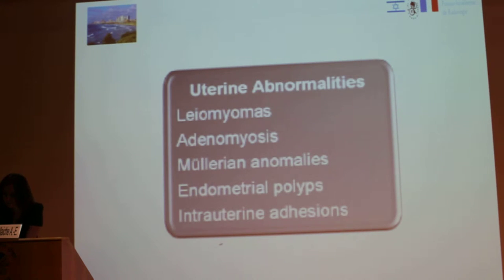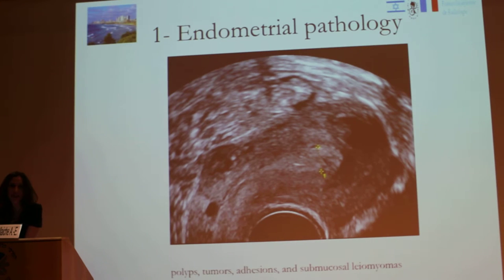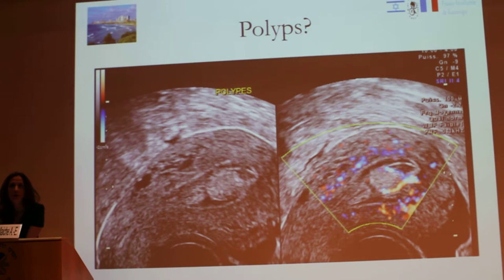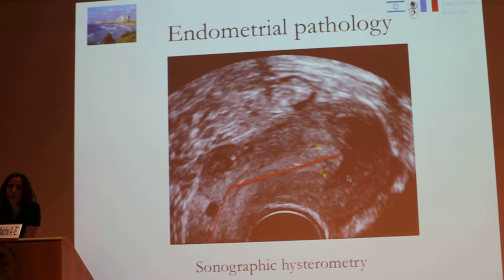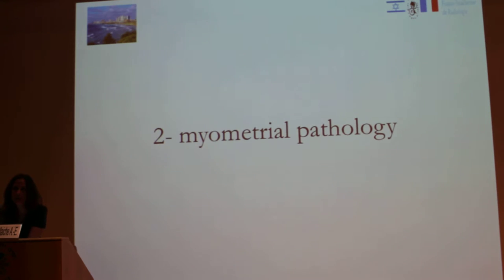For uterine abnormalities, the first etiology is endometrial pathology. Here you have an example of a polyp. It is important to take precise dimensions of this polyp before hysteroscopy. You can perform biometry of the cavity from the external cervical orifice to the depth of the cavity, which is important for eventual IVF after infertility management.